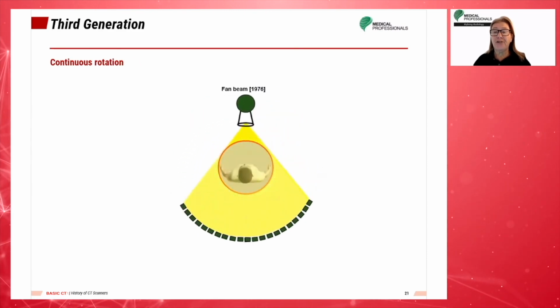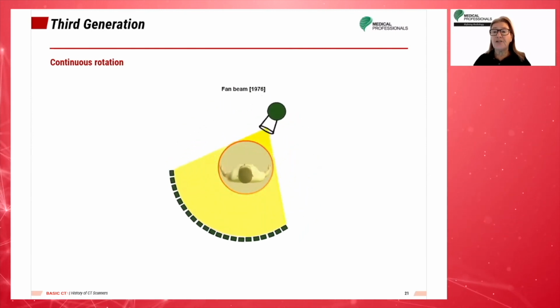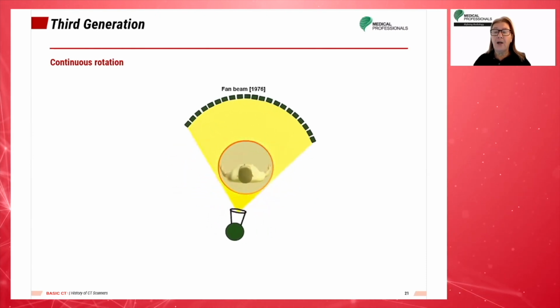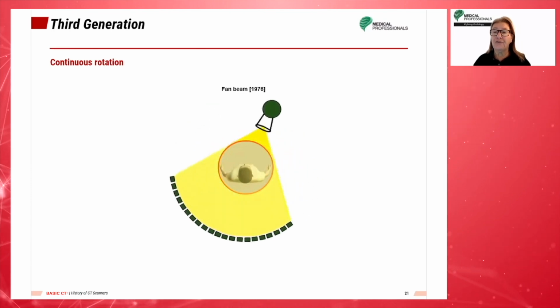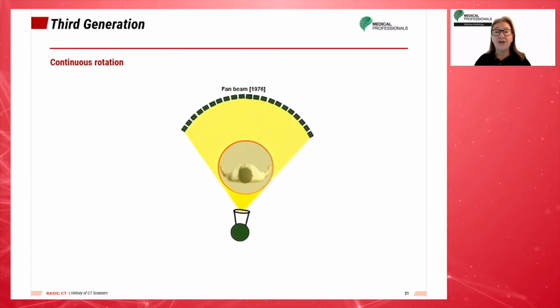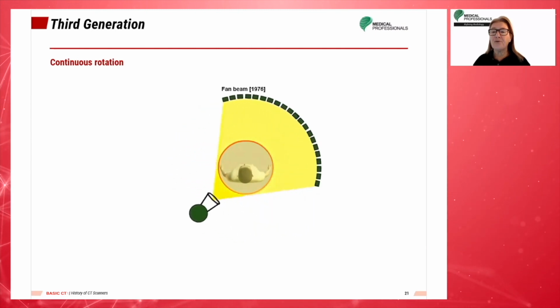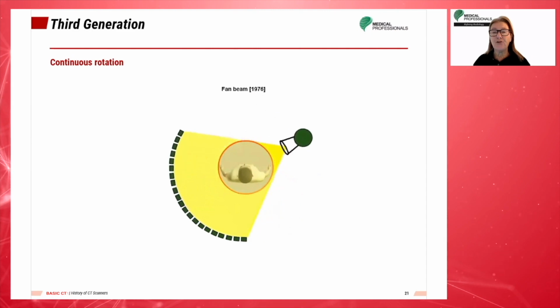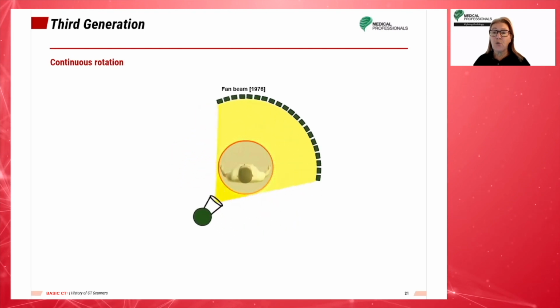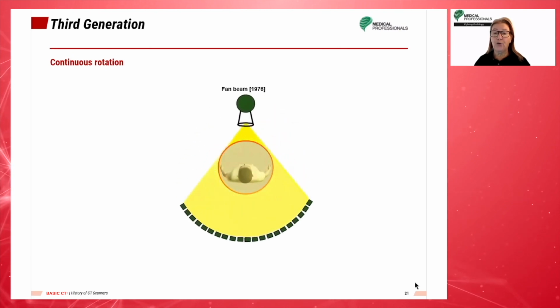In the third generation, huge modifications were applied. These units used a wider fan-shaped beam and a curved array of 250 to 750 detectors to acquire a single projection. The detectors could be collimated to reduce the amount of scatter. Scanning times were reduced to between 1 and 12 seconds, allowing images to be produced sequentially to approximate dynamic functions, though in a crude manner.